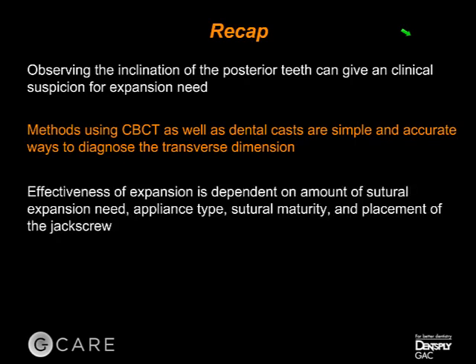The current methodology that we're using right now is showing that expansion effectiveness may start to have a shift in terms of the thought process based on the amount of sutural expansion need, the sutural maturity, the vertical placement of the screw, as well as now the appliance type that you use.